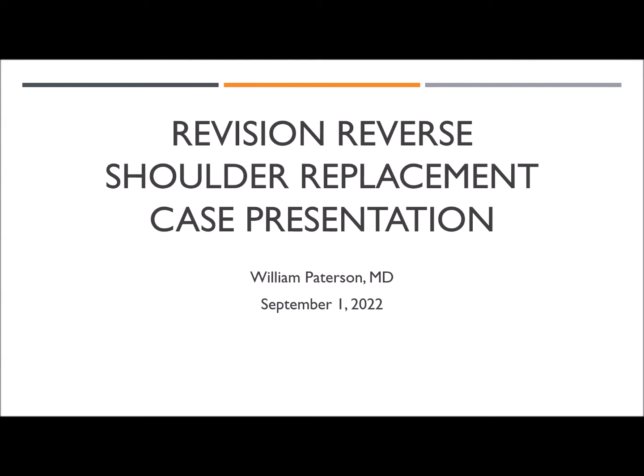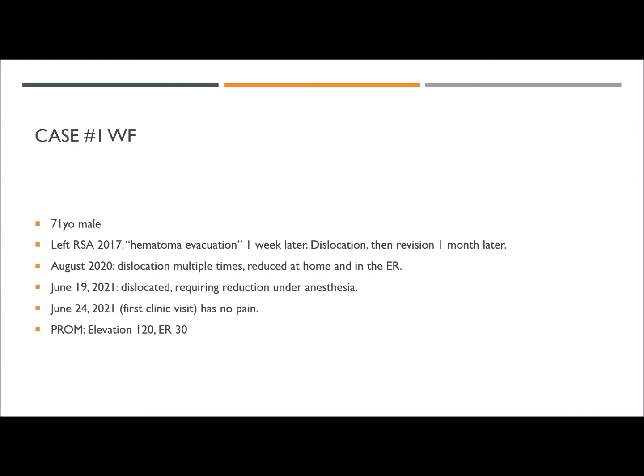Okay. Yeah, I've gone through that same variability philosophy. When I came out, I was essentially doing a Grammont style, and now I'm doing more lateralization on the glenoid, and it's not exactly inlay, but a thin onlay, essentially just the poly is the onlay on the humerus, so there's not as much lateralization.